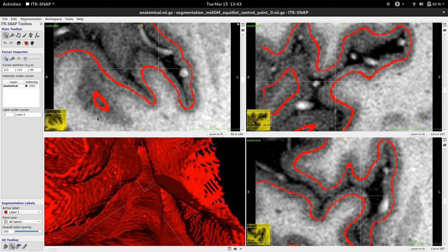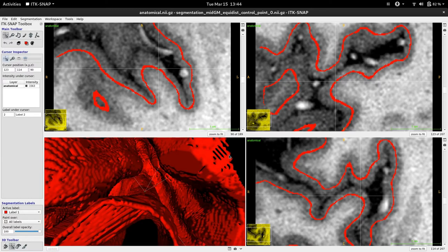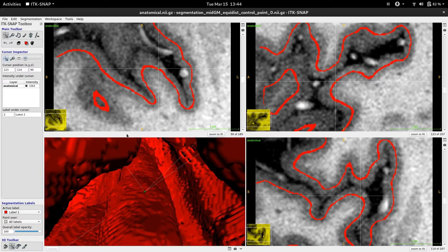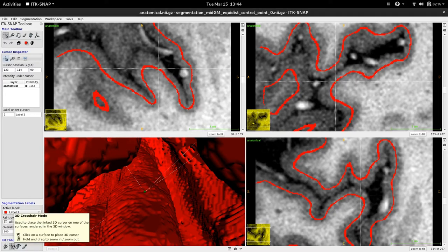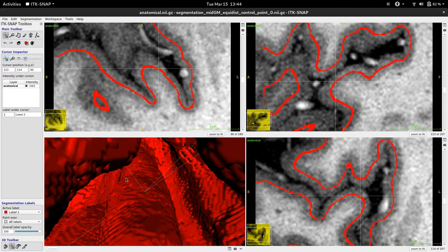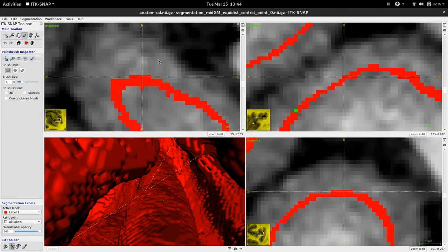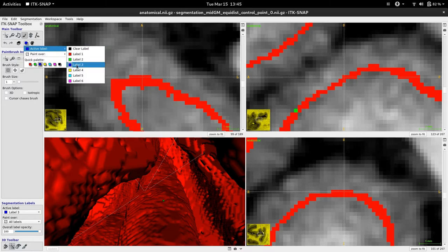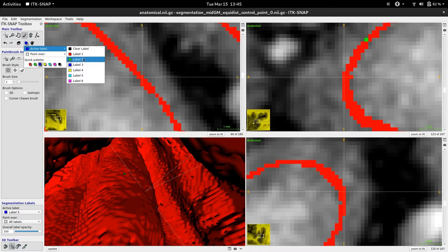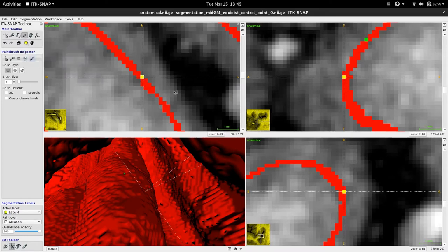What we need to do is to find four other points. The first two points will determine the first axis, and the second two points will determine the direction of the second axis. I am going to have a nice angle and zoom in to this region, and make sure I have the 3D crosshair mode. Just for the sake of example, I would like to show an axis crossing diagonally to Heschel's gyrus. I click here — it brings me to the correct voxel in the volume space. Then I zoom in, change to brush mode, and label one voxel with the color blue, or label 3. Then I select label 4 and put one voxel there.